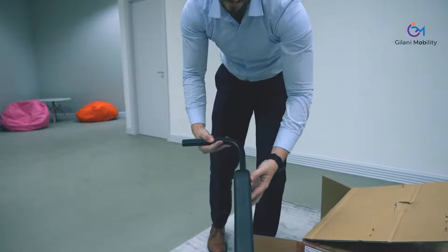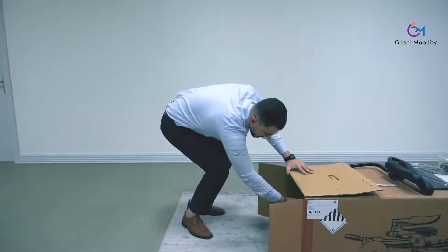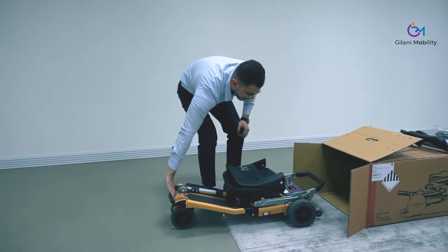What we are demonstrating here are the little storage bags. You can see here how we pull out the Luggy scooters. It comes fully assembled and ready to use.